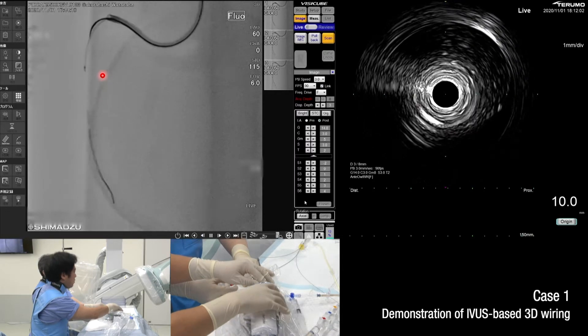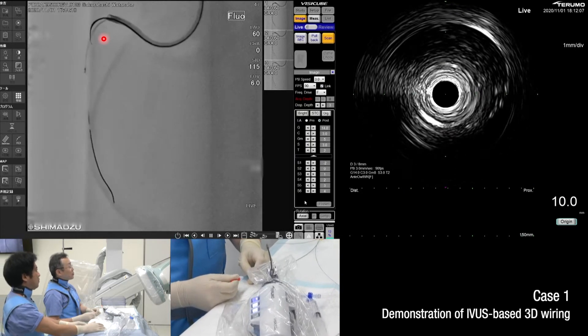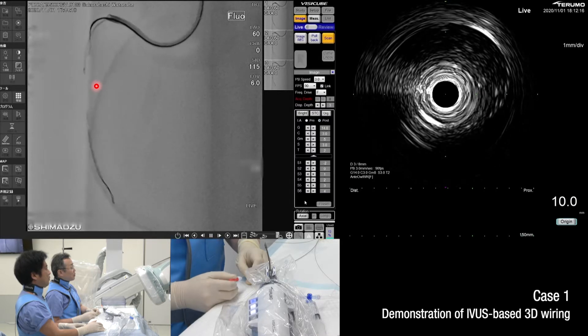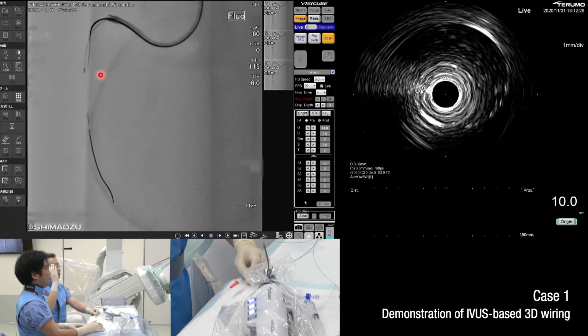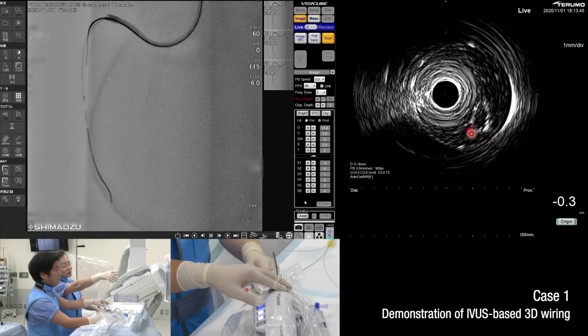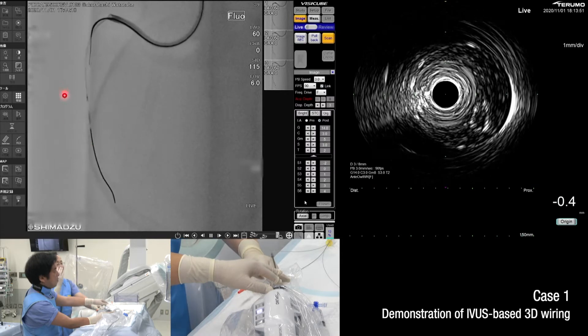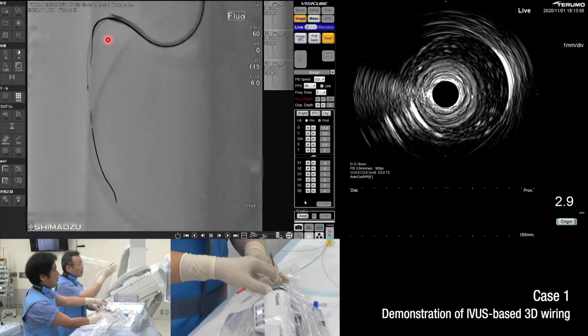I will pull back the IVUS transducer one centimeter proximal. Now I will advance the guide wire to the IVUS transducer level angiographically in 2D. After that, I will check the location using the IVUS. I advance the guide wire one centimeter before the target using the tip detection method. On the IVUS image, the target is at 5 o'clock, but on the fluoroscopy image you cannot yet determine where the target is.